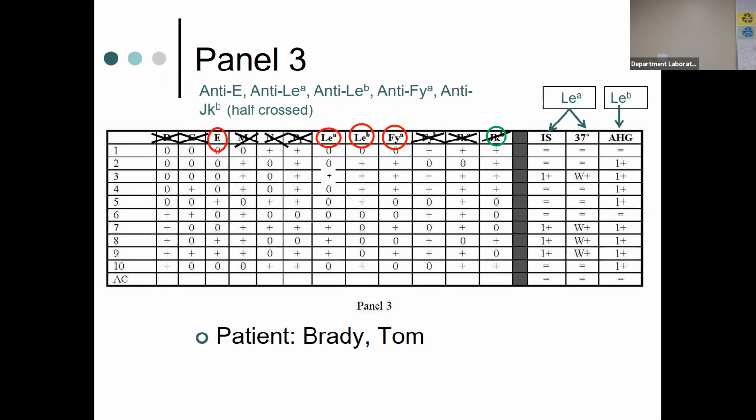So this patient, what do you think his genotype is for the Lewis A and B? A negative, B negative? Yes, he has to be Lewis A negative, Lewis B negative. Remember, you have to be negative in order to build the antibody. Does that make sense to everybody? Do you see how you have to go back and account for every reaction? It's a good idea, and you've seen in some of my examples how I'll circle the reactions. That lets you know that you have accounted for every reaction in your patient plasma. That identifies every antibody, every reaction.